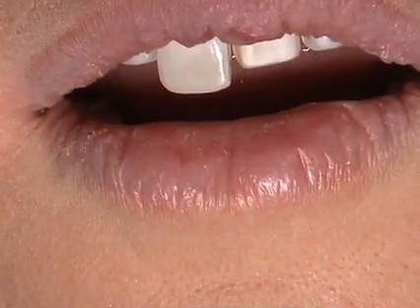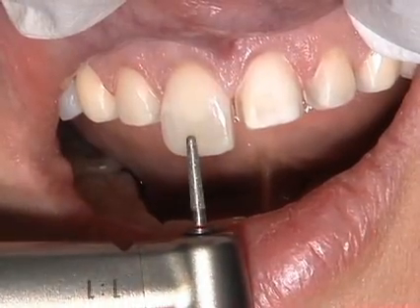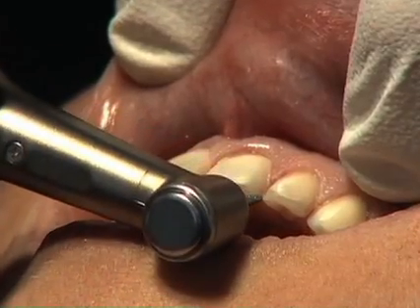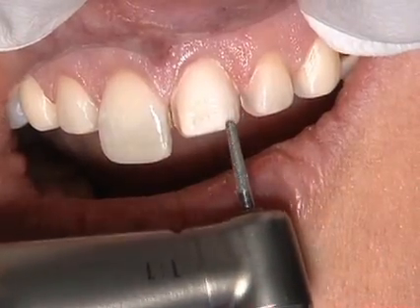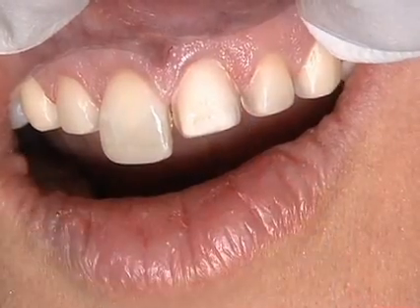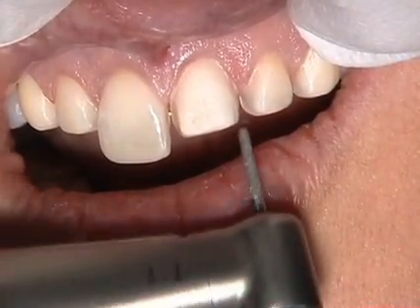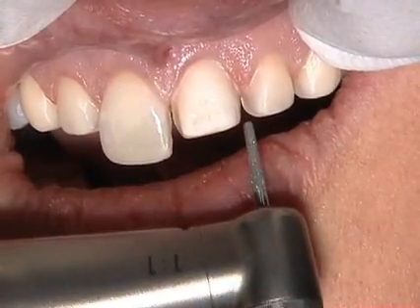Discussing the interproximal reduction — I had stated we're breaking the enamel contact. Because I've left the right central unprepared, I sometimes reduce that a little bit to make sure I don't over-reduce the actual prepared tooth. You can see there is maybe one or two tenths of a millimeter space between the enamel interproximally — between central and lateral, and the same between lateral and canine. This allows me to wrap the porcelain around interproximally, develop the best translucency in the final veneer, and avoid any staining or discoloration as the years go on.